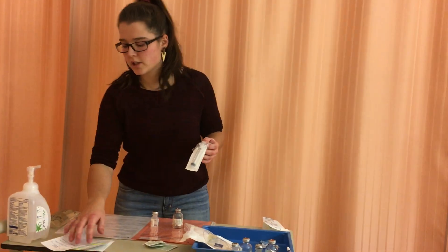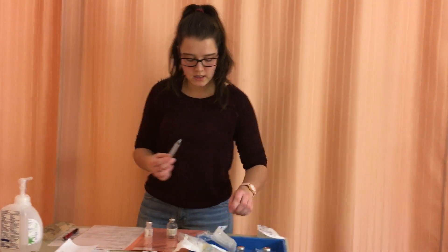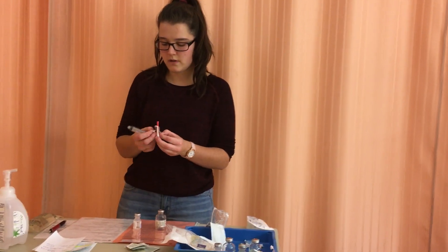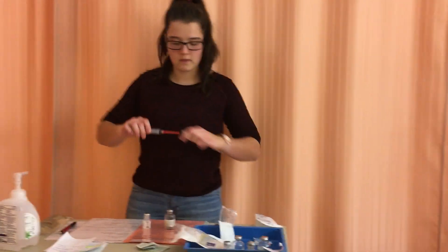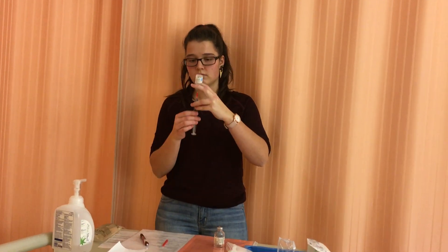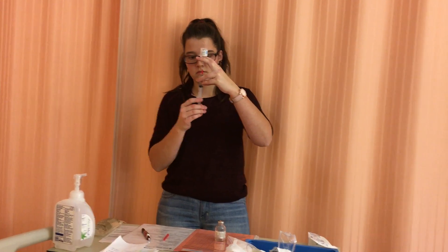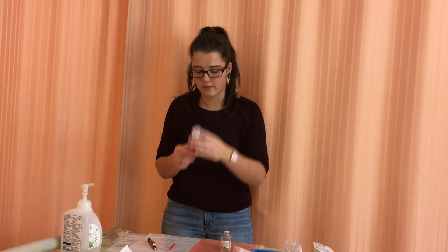Now I'm going to pull up the 6.8 milliliters of sterile water I've measured. I'm going to open everything using sterile technique, being careful not to contaminate my syringe. I'll inject air into the vial first to create pressure, then pull out the 6.8 milliliters. I have 6.8 milliliters and no bubbles.